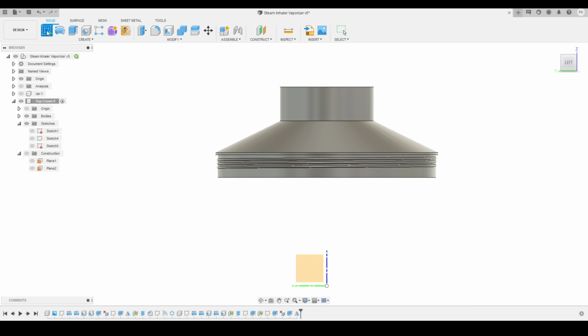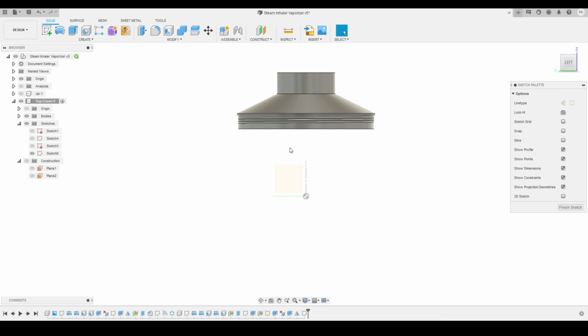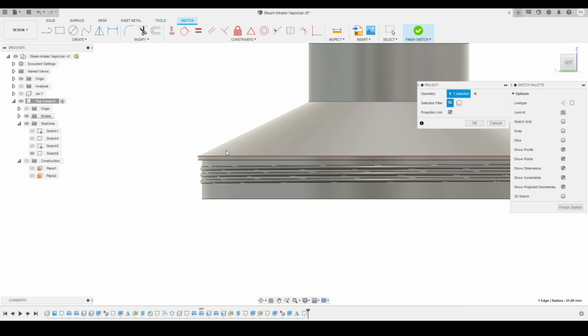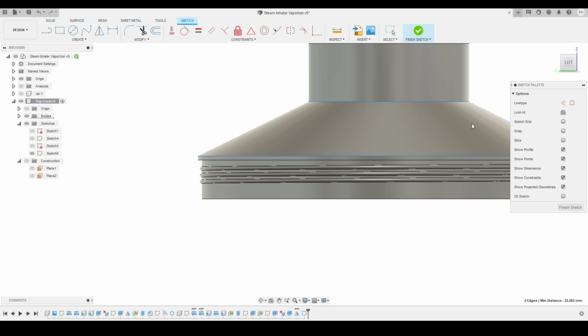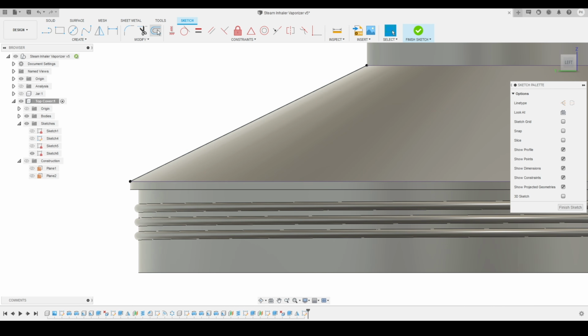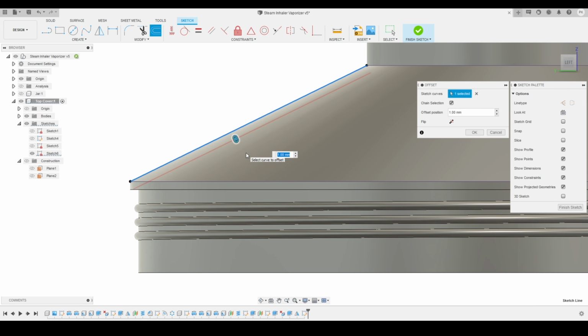Now we'll activate the create sketch tool. We'll select this plane, and here you can see we are going to create a clip on this face. So I will select these two features, activate the project tool, and then we'll connect these 2 points by a line. Now I'm going to offset this line by minus 0.3 millimeters.